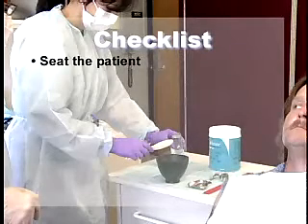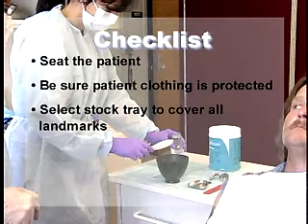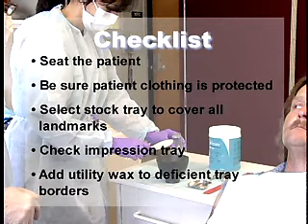Seat the patient and be sure the patient's clothing is protected with a napkin. Select the stock tray that will cover all the landmarks indicating the denture bearing areas. Check the impression tray and make sure it covers the hamular notches posteriorly. Deficient tray borders should be corrected by adding utility wax.